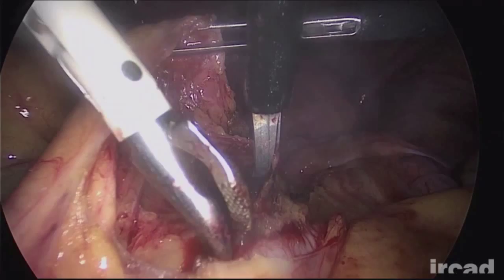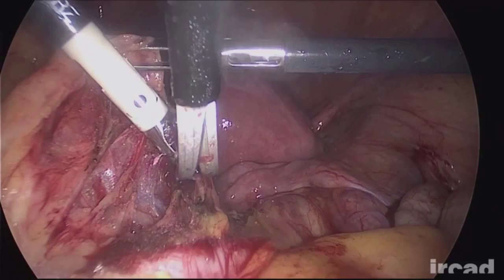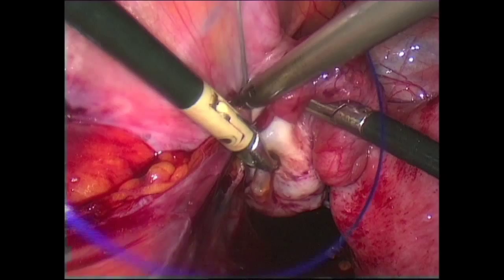In addition, one of the limitations of the technique is that the assistant has only one free hand to help the surgeon. If the assistant uses the grasper to hold a structure, he becomes unable to participate in the dissection.